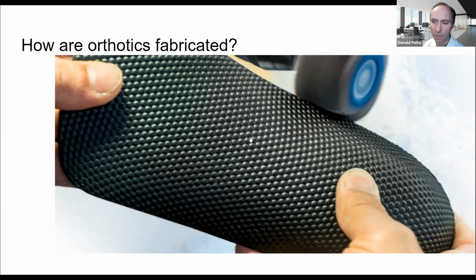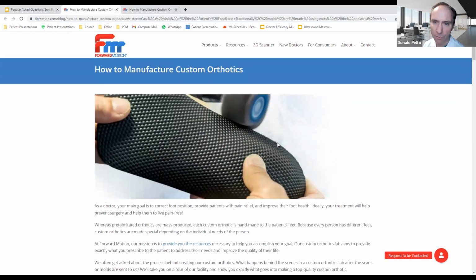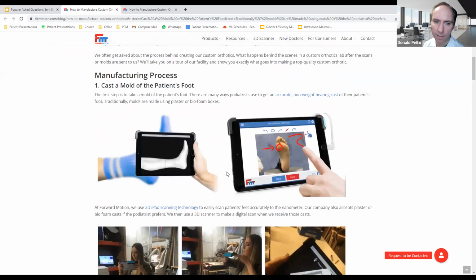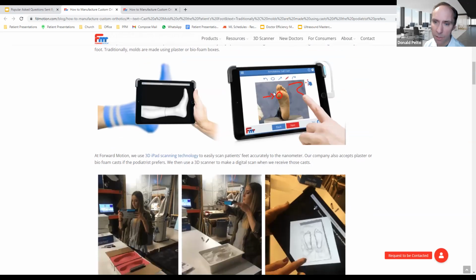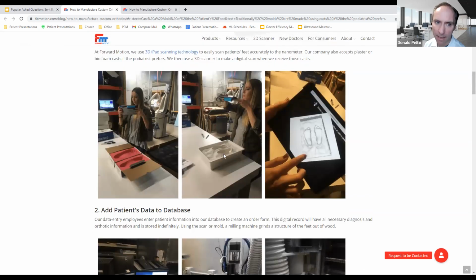I am going to show you the process, and I'm going to use the process from where I get my orthotics, which is Forward Motion. When a patient comes in, we have this 3D scanner, and I will scan the bottom of the foot. It's really cool because it does a 3D impression. I think in the future, and we actually already exist where we can print them in our office, but we don't do that. We make little modifications. We note where they have high pressure points. And from that, they make an impression.